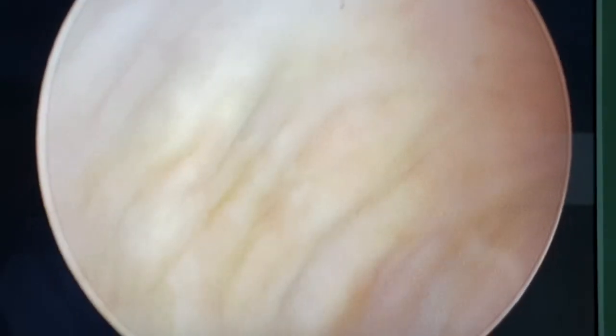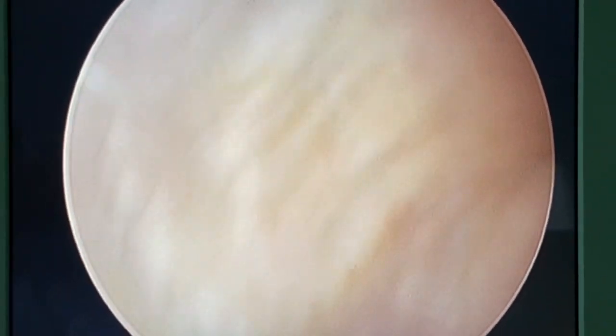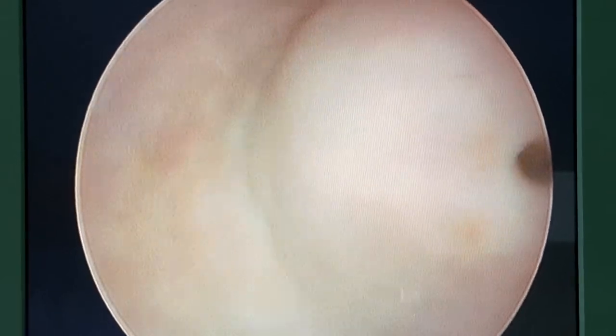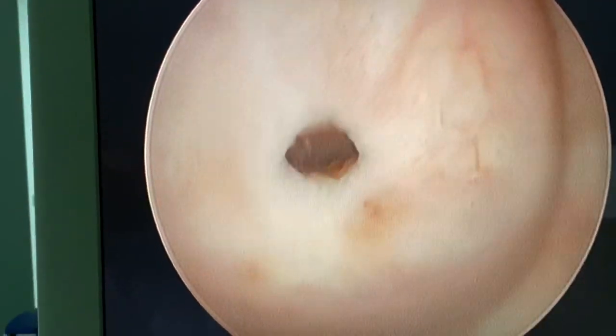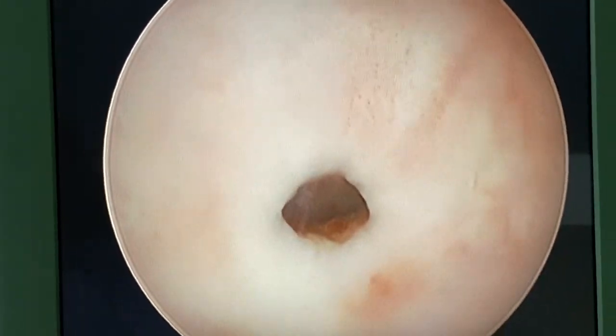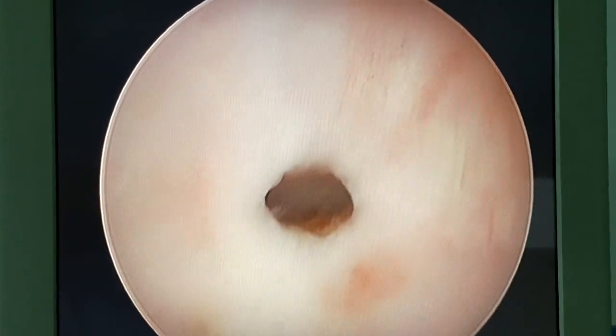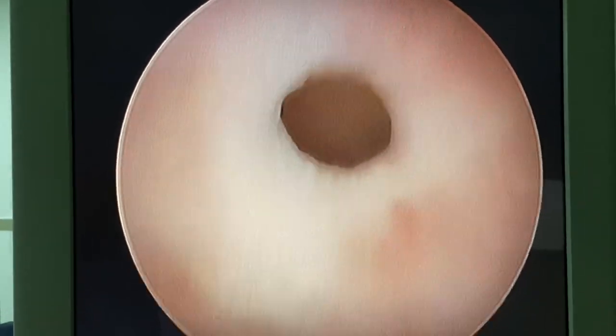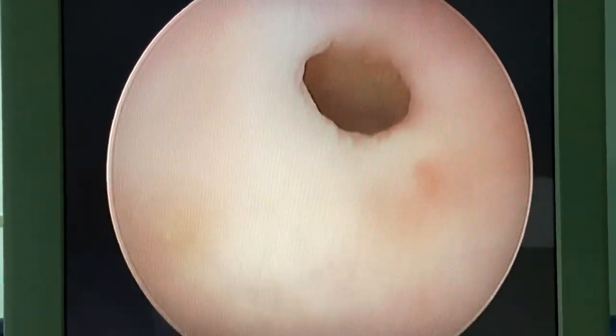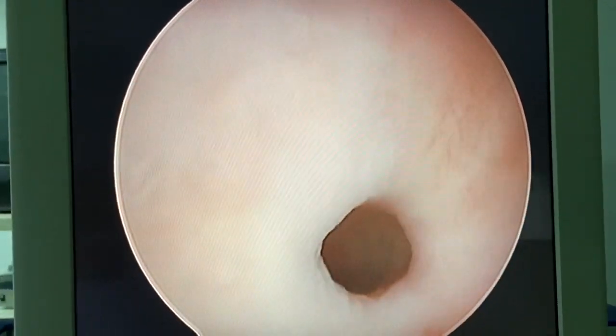That's the vaginoscopy view. Always remember to readjust the focus. In hysteroscopy, it's not like laparoscopy — changing the focus is very mandatory. That's a nice vaginoscopy and that's the external os, a very nice nulliparous external os. Use the fluid pressure to dilate the external os, like a car wash, and then go gently inside.